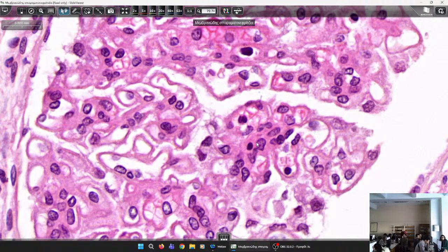Which are they? Which are the podocytopathies which are negative or non-specific in immunofluorescence and could cause nephrotic syndrome to the patient.